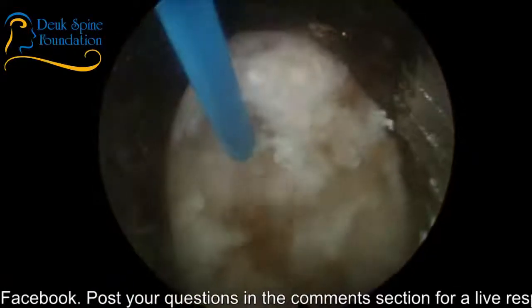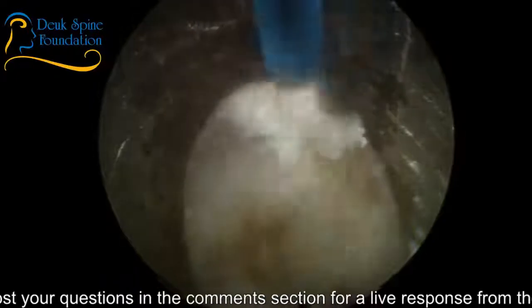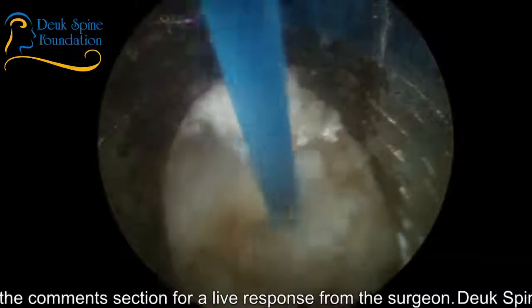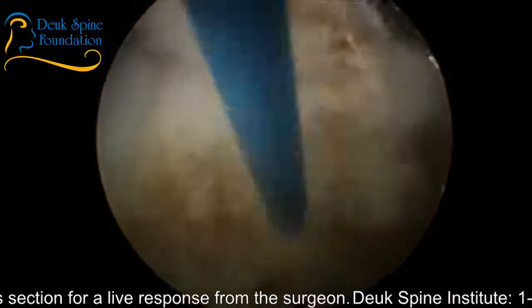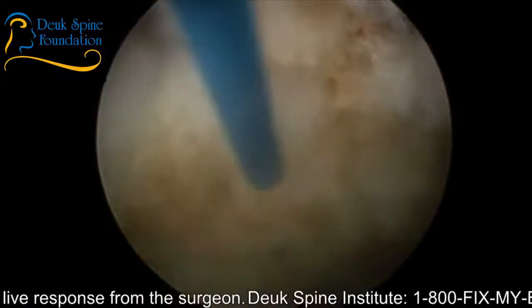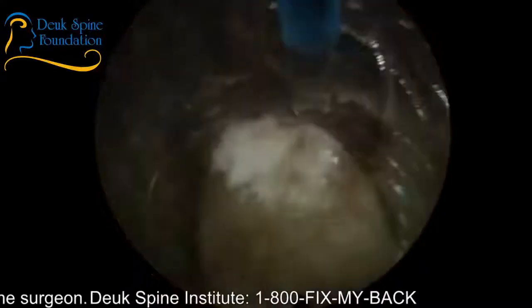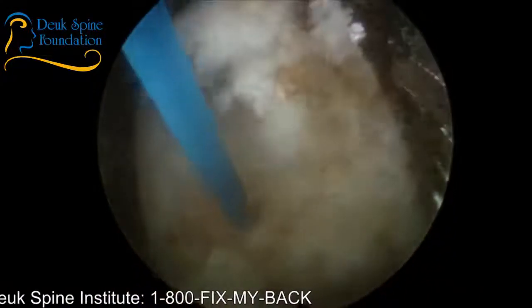Let me just see what I can do here without breaking the scope. Yeah, I think they did a good job with the scope, Luis. I can't tell, because the blue dye's not here, just how good of a job they did. I mean, what are your thoughts? You're seeing what I see, right?